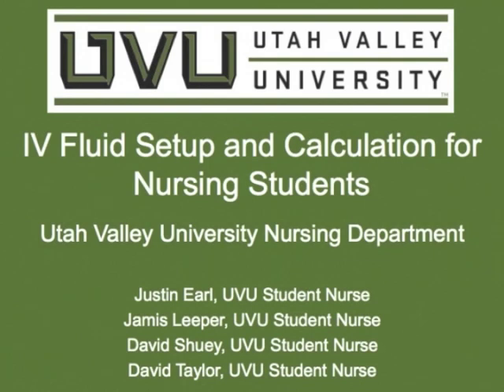Welcome to the Utah Valley University IV fluid setup and calculations video. Today we will be demonstrating how to prepare an IV line and set a drip rate.